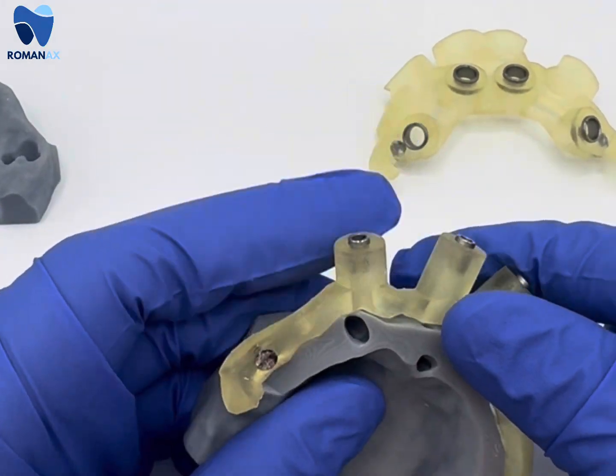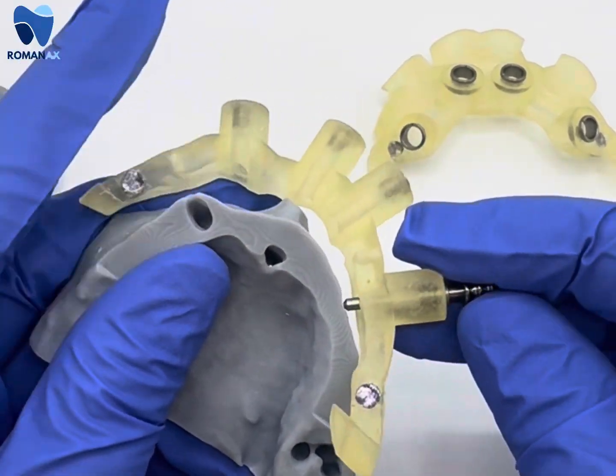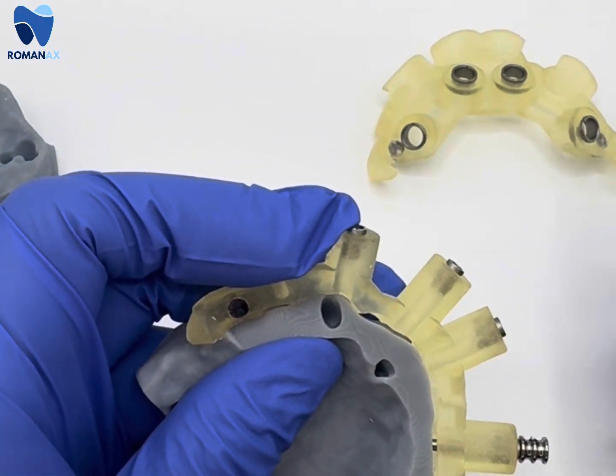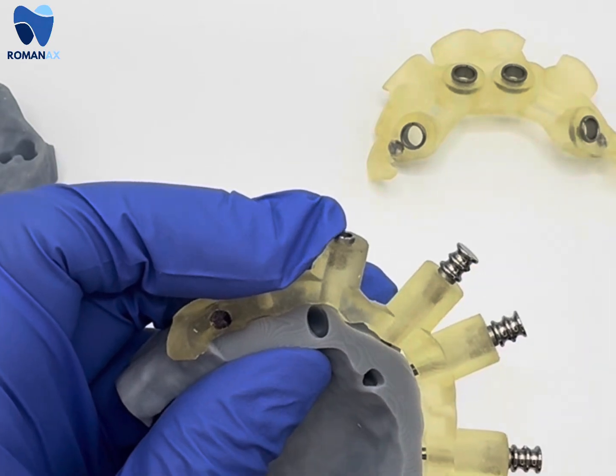Here we're going to simulate that the bone has been reduced and we're going to put these stabilizing pins back on this next model. In surgery the doctor would not have to switch the models obviously — once the pins are in, they stay in.